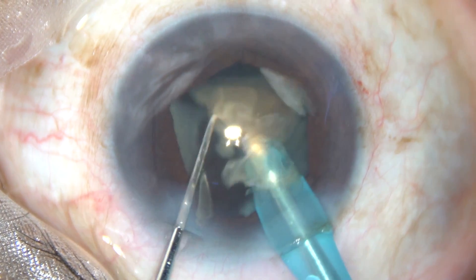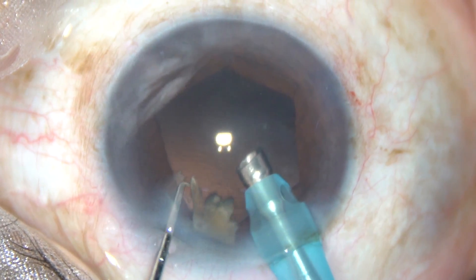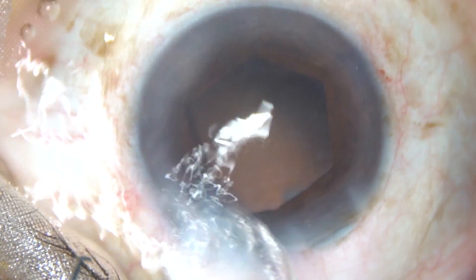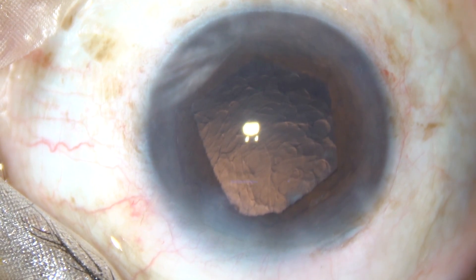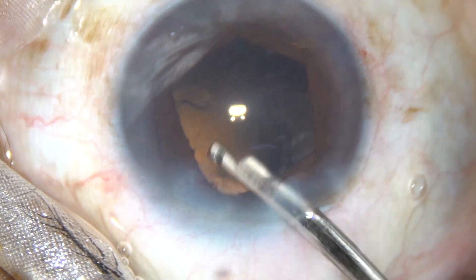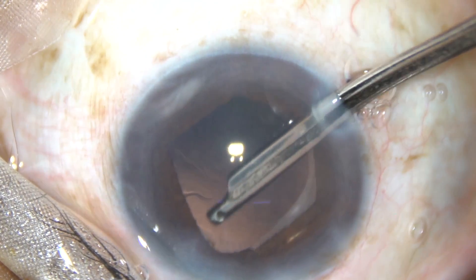I keep the nucleus management part intact and do not edit that portion. This is the last bit, and now these small bits come out through the side port. I then remove the phaco handpiece. The B-Hex — a portion of the flange which was above the iris at around 3 o'clock — has gone behind the iris, and the pupil has taken almost a pentagonal shape.